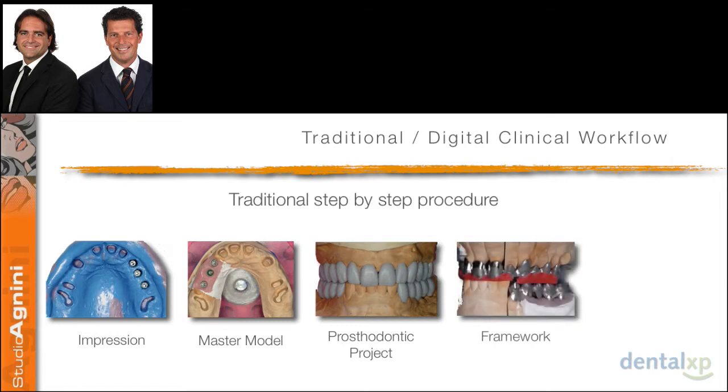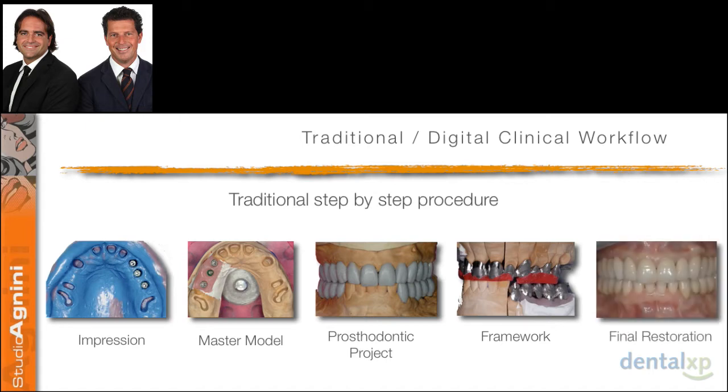The frameworks will come to our office. We will try them in. If everything looks okay, we can have the bisque bake. We try the bisque bake in, and at the end of the treatment plan, we can deliver the final restoration to the patient.